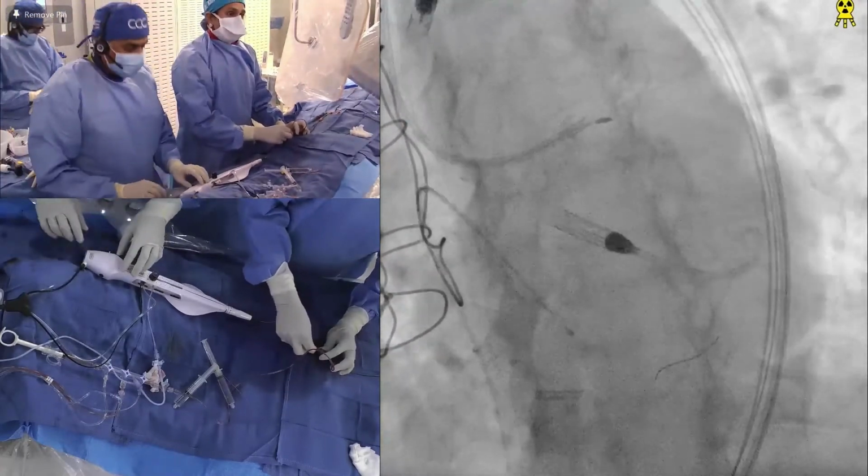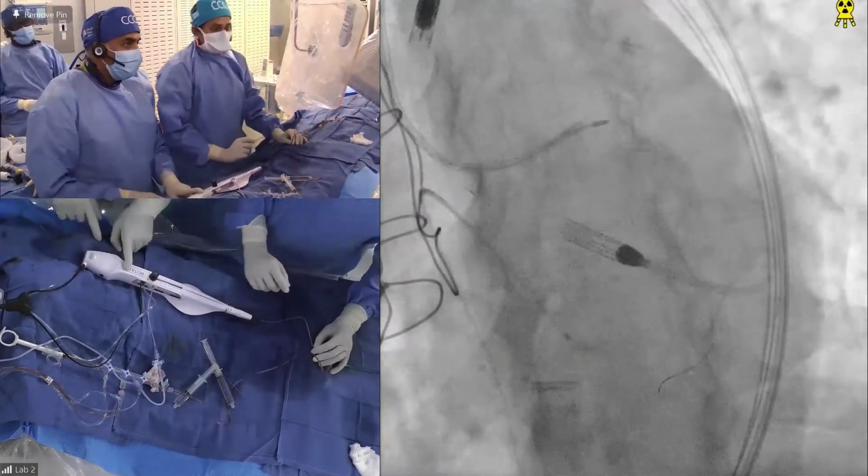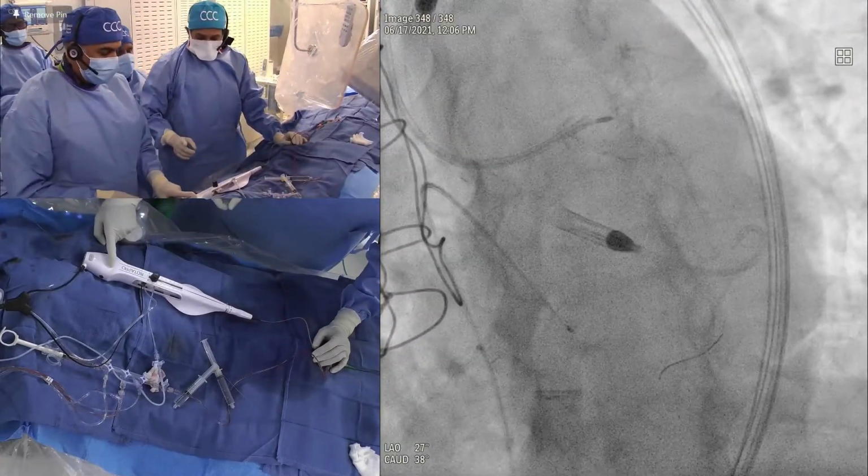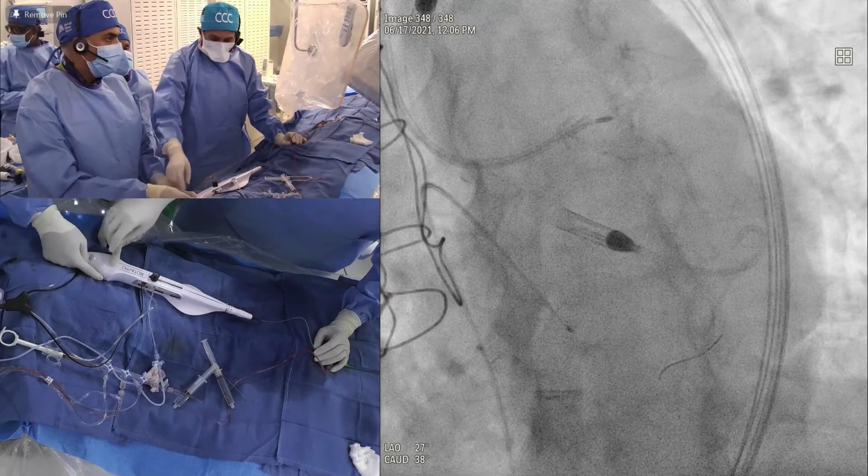So Dr. O'Neill had a point to make. Dr. Kinney, one second. Dr. O'Neill? I found the Turnpike LP probably the most crossable of the micro catheters.